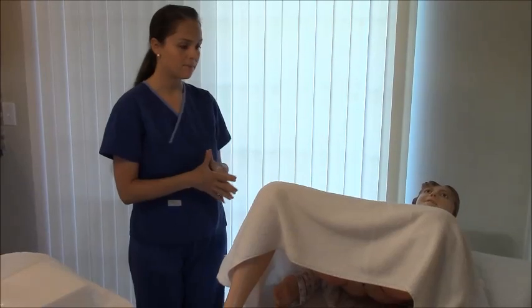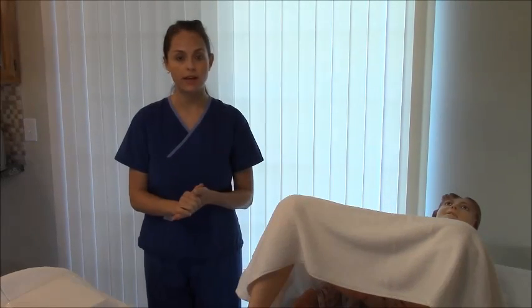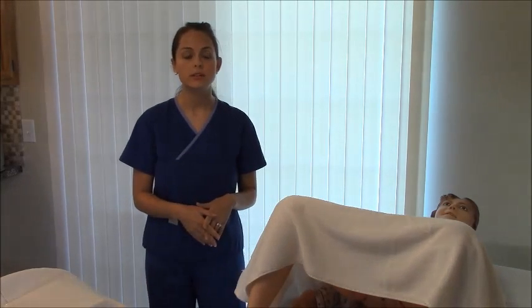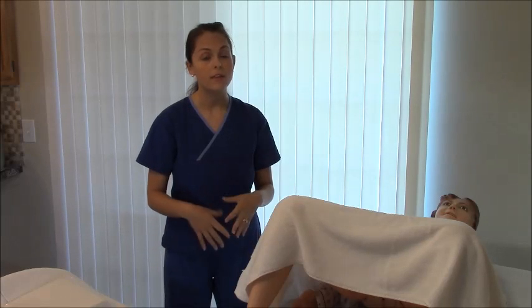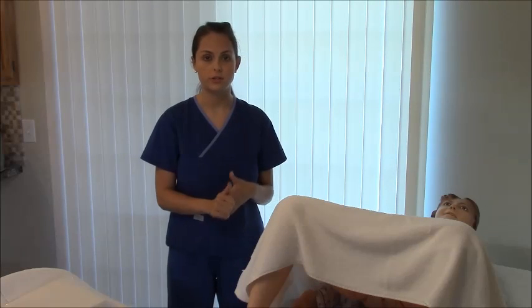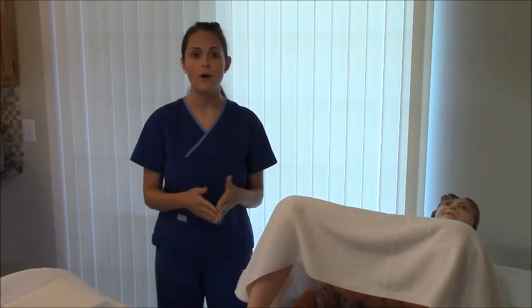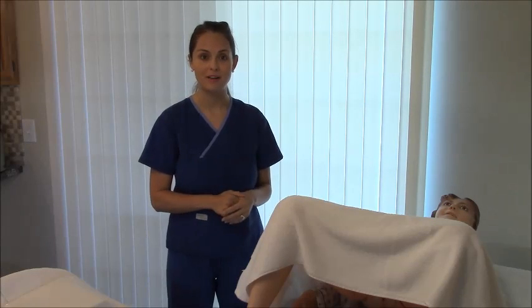Right here we have Ms. Smith, our mannequin patient. Before you even insert the Foley catheter, you'll want to discuss it with your patient to make sure that's something they want. Discuss how it's inserted, what position they'll be in, that they'll be exposed momentarily in their private region, and the risks of the procedure. A lot of patients don't know what a Foley catheter is or where it's inserted, so always let your patient know.